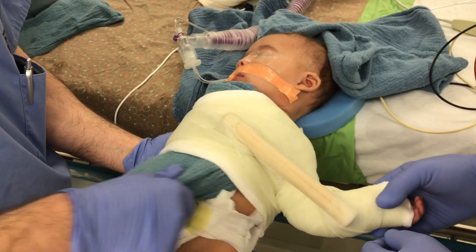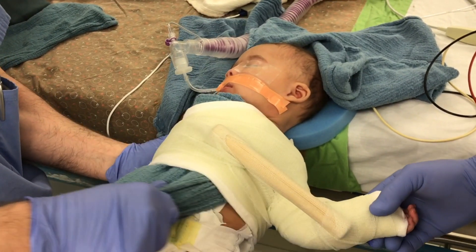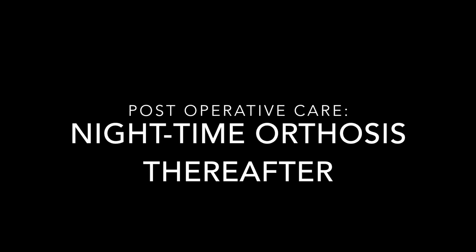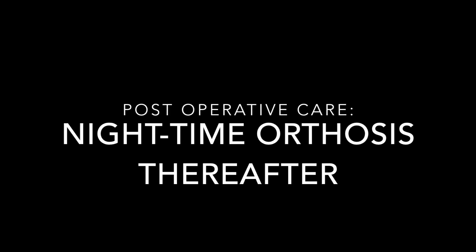The towel is removed and the patient is awakened from anesthesia. The cast is maintained for three to four weeks, after which a nighttime orthosis is used until the patient recovers active external rotation and abduction. For more information, visit us at littlearms.org.